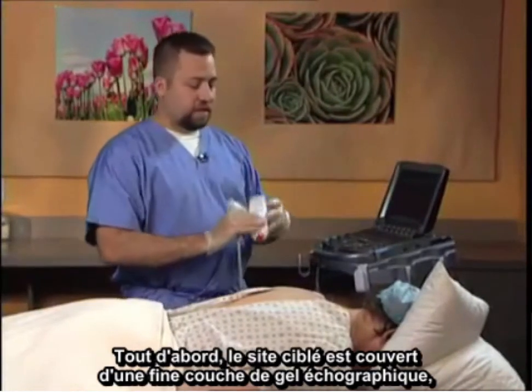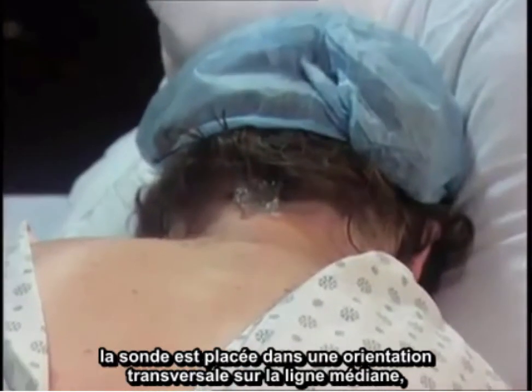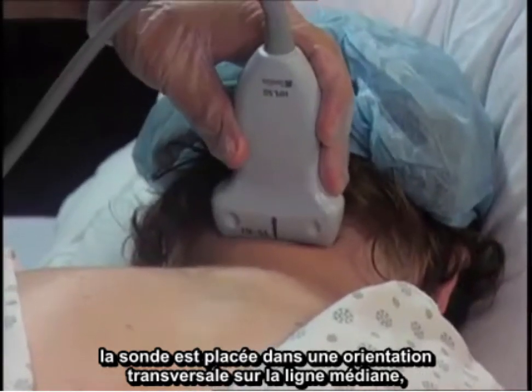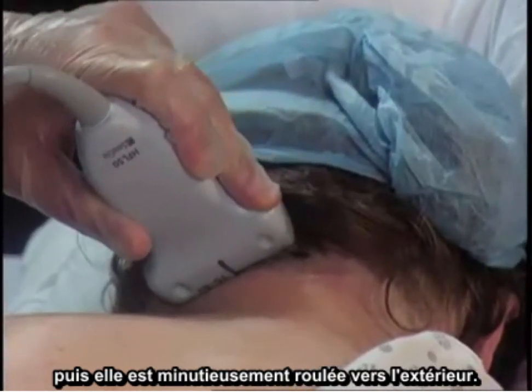To commence, the target site is covered with a thin layer of ultrasound gel. Then the probe is placed in the transverse application at the midline, and then the probe is gently rolled out.